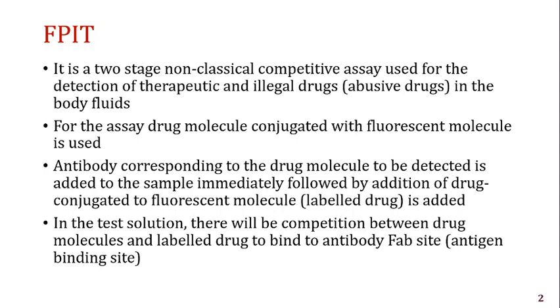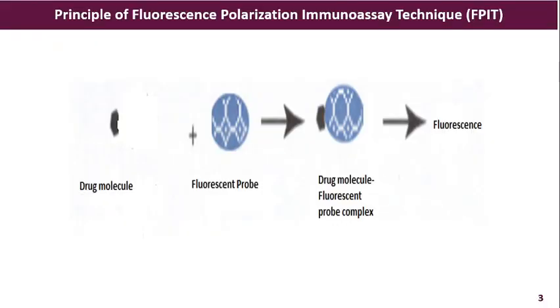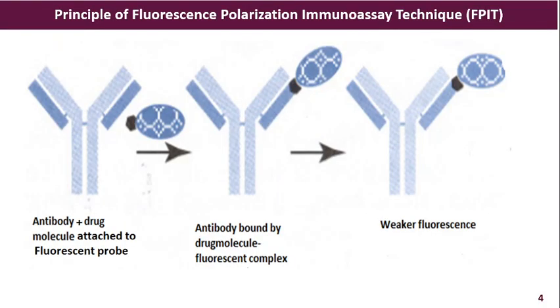Therefore, in the test solution, when you add the antibody, if the suspicious drug molecules are present, they will engage all the FAB sites of the antibody and the antibody will not be available to bind to drug molecule fluorescent complex.